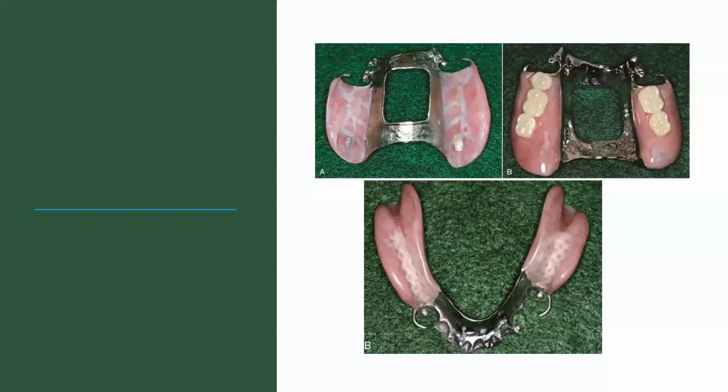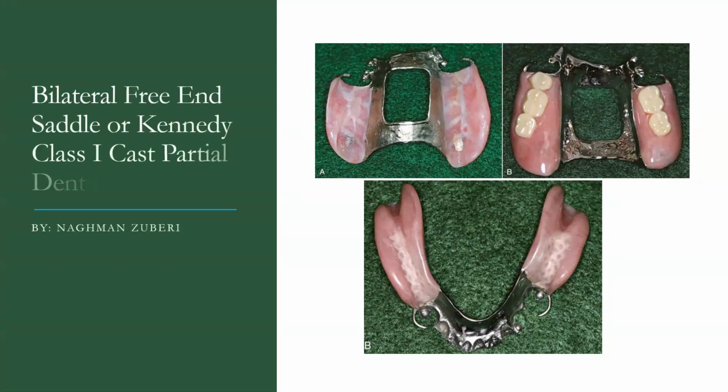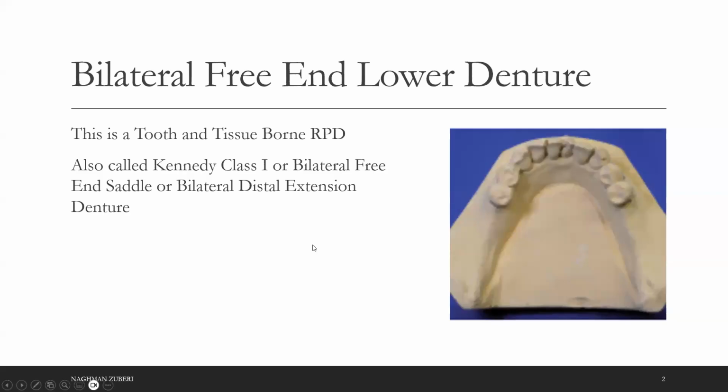Good evening, guys. As I promised that I will be coming back this evening sometime with a lecture on the bilateral free end saddle or Kennedy class 1 cast partial dentures. So here is the small lecture on that. Bilateral free end lower denture.